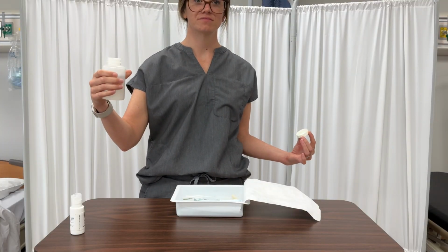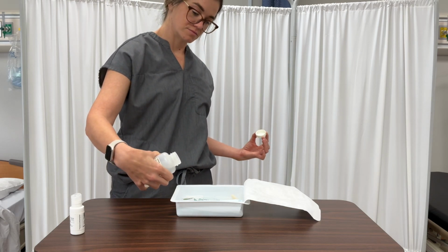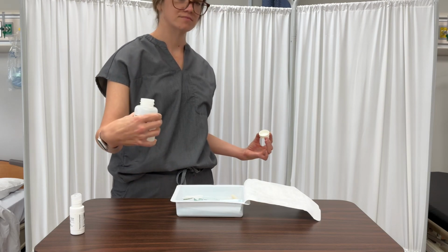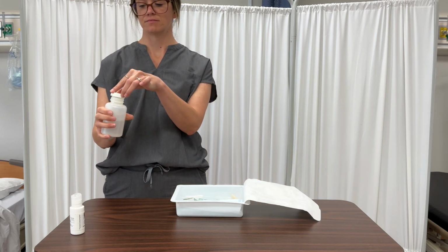With the solution bottle held 1 to 2 inches above the sterile receiving container, you want to slowly pour the needed amount of solution into the container. You're going to make sure that you hold that bottle with the label facing in the palm of the hand, just like she is. Okay, and that is how you do your pouring of the sterile solutions.